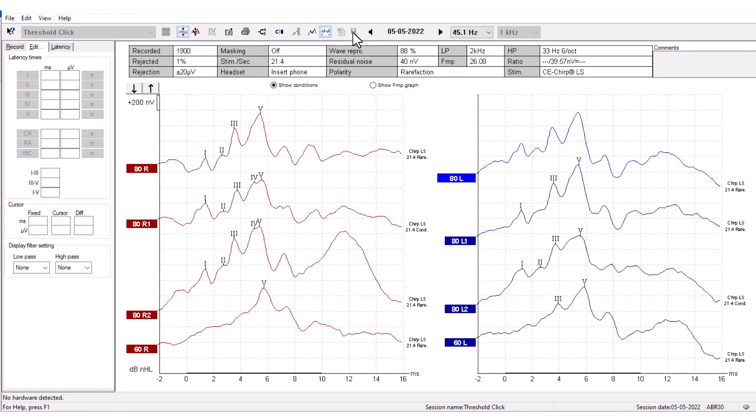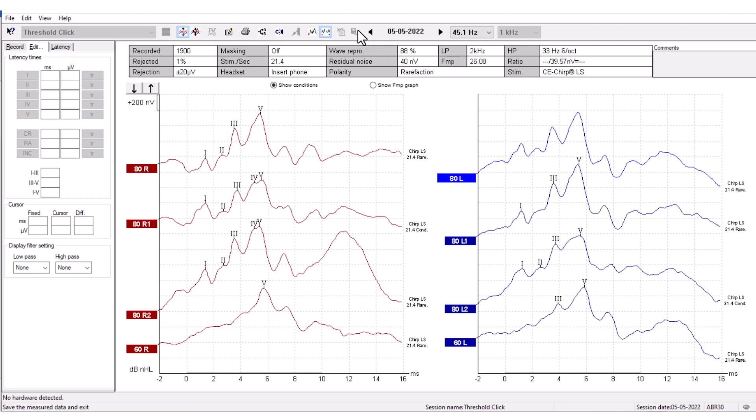Save and Exit saves the recording and returns you to the patient database. The session will also be saved in the database. However, you must make any modifications to the test results before saving the original session.